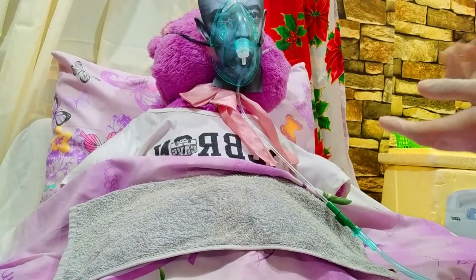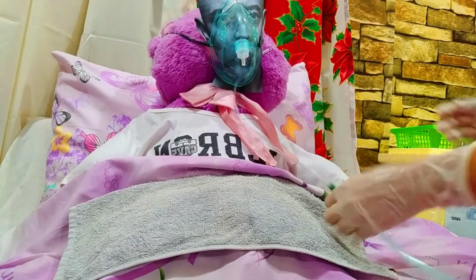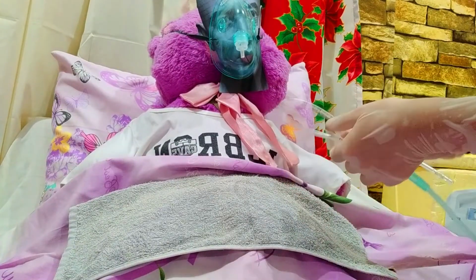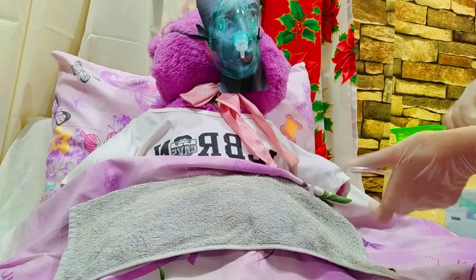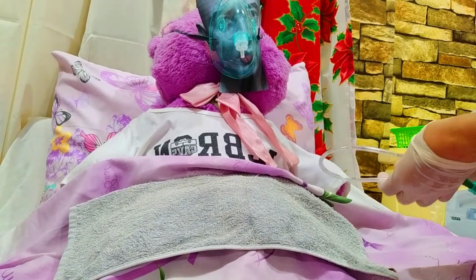When suctioning is completed, we need to remove the glove from the dominant hand over the coiled catheter, pulling it off inside out.